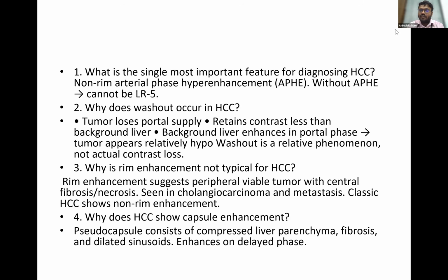Yes. Why is rim enhancement not typical for HCC? Rim enhancement suggests peripheral viable tumor with central fibrosis and necrosis, which is seen in cholangiocarcinoma and metastasis. And in HCC, why does it show capsule enhancement? Pseudocapsule consists of compressed liver parenchyma, fibrosis, and dilated sinusoids, which enhances on the delayed phase.